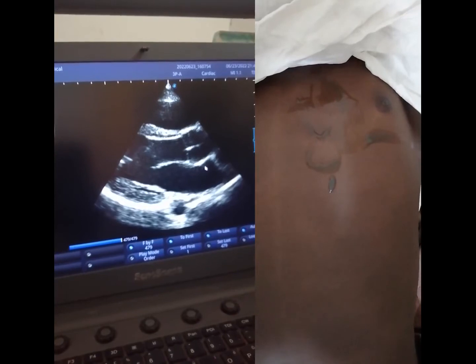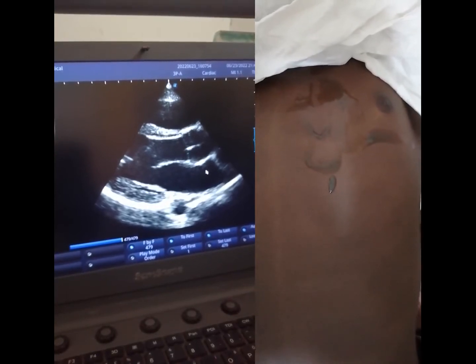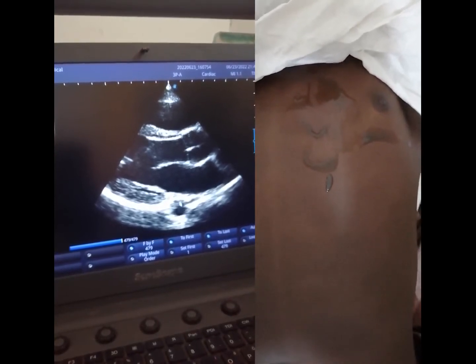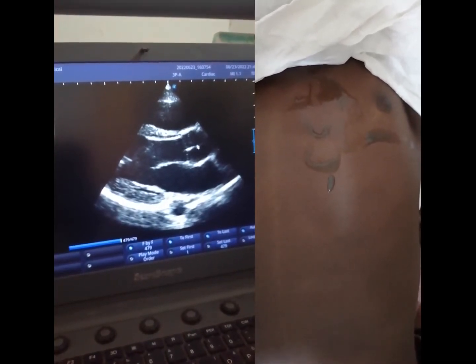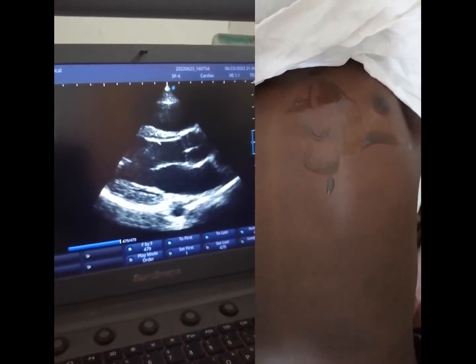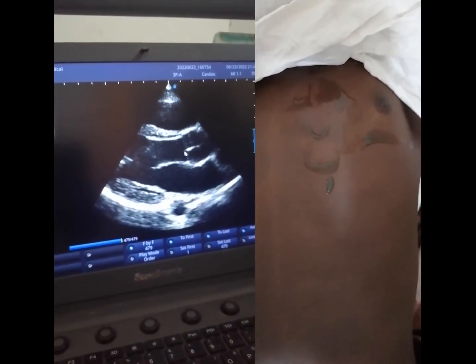Once again, here is the RV, here is the LV, here is the left atrium, here is the ascending aorta, and here is the LVOT.